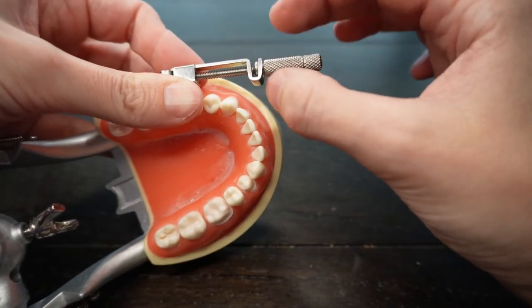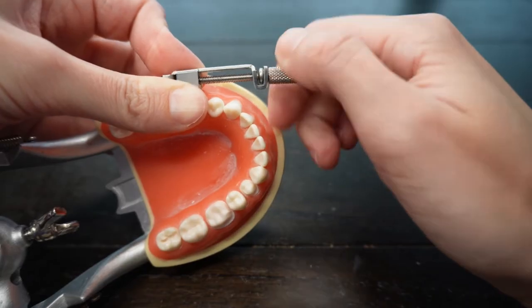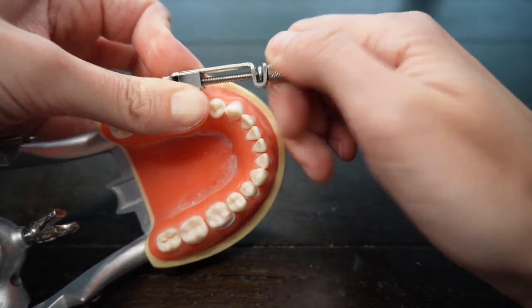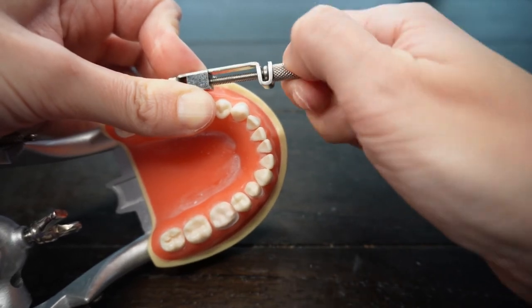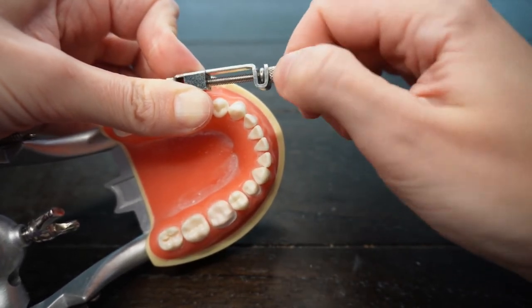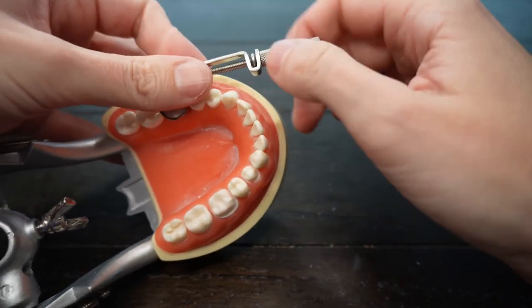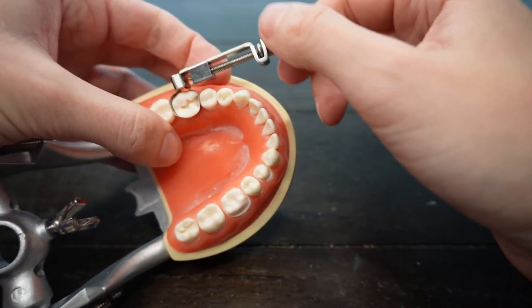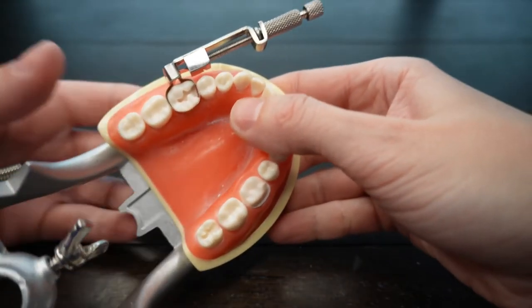And you're using this screw, remember this screw, to adjust the size. So in order to adjust the size, I'm gonna go clockwise. I just rotate this screw clockwise till it goes tight, till the band goes tight around the tooth. This is pretty good, this is tight enough. I can tell I will have to apply some force to take it off.